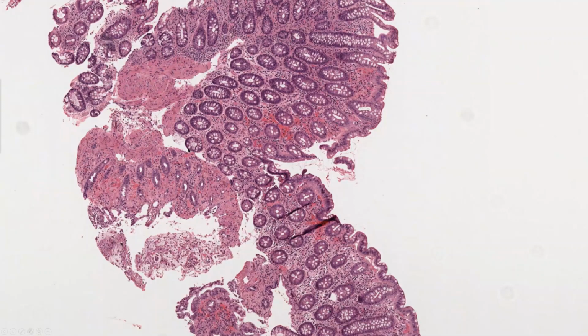When I told you the weathered crypts are the unhealthy crypts that sit next to a healthy one, and I described it for you like a tubulitis that we see in renal pathology. In tubulitis, you tend to have the lining, the cells become fainter and more diseased, irregular. They look very unhealthy. And this is what you get of that name, weathered crypt.